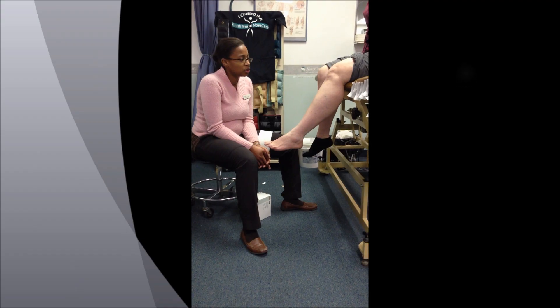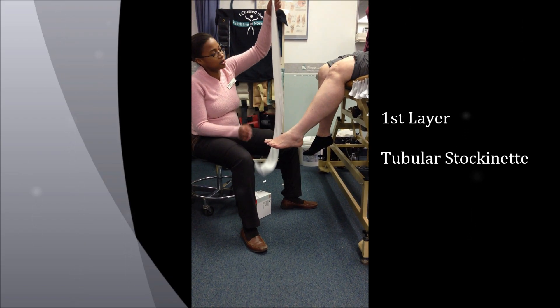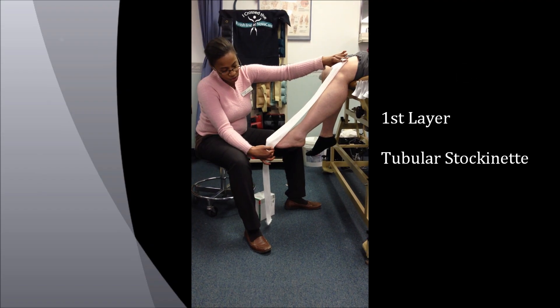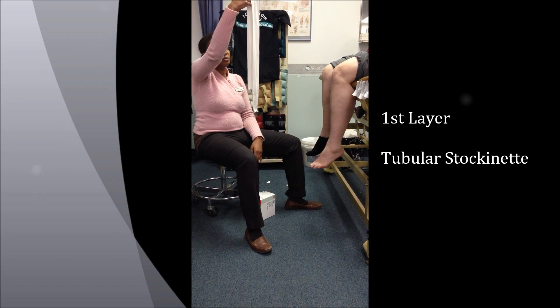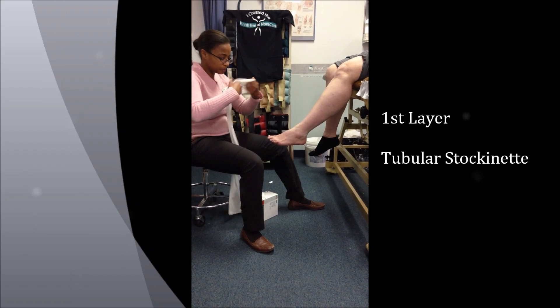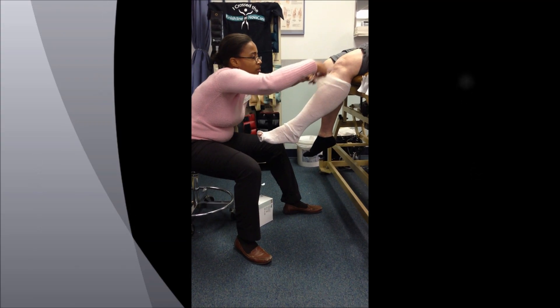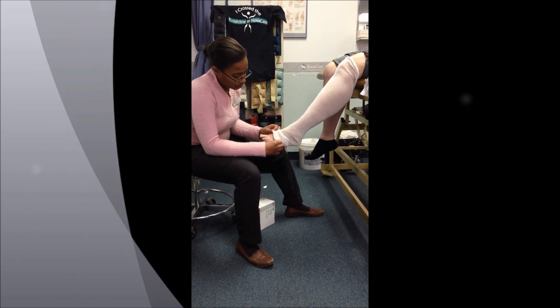The first thing we are going to do is use the tubular gauze for protection of the skin as the first layer. The way that you measure the gauze is that you measure from the top of the knee to the toes, and then it's doubled. From there, that is then used as your first layer, your stocking, and cover.